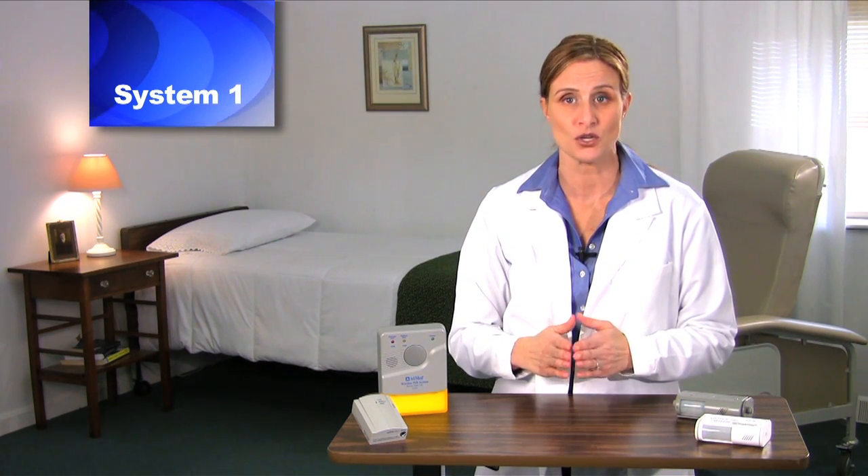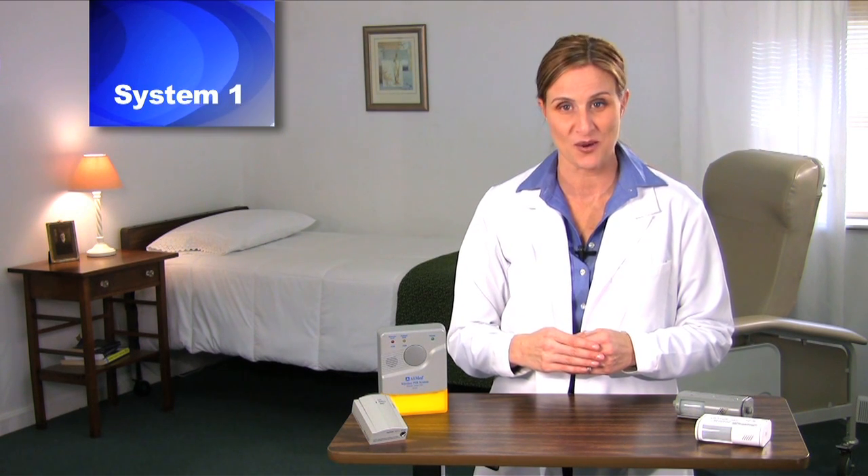The sensor unit features an on-off switch and two alarm tone options: alarm or chime. For mounting, choose either the bed or wall mount. For more detailed instruction on System 1, please see video 1.